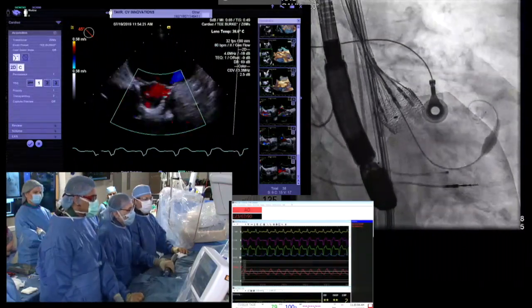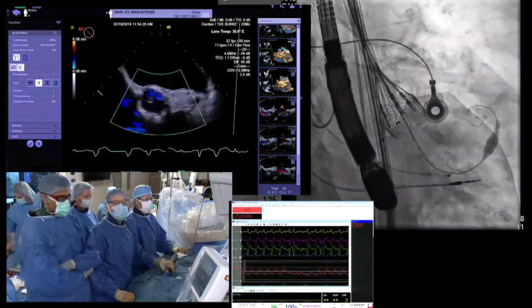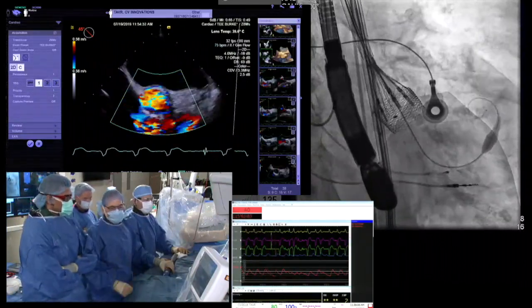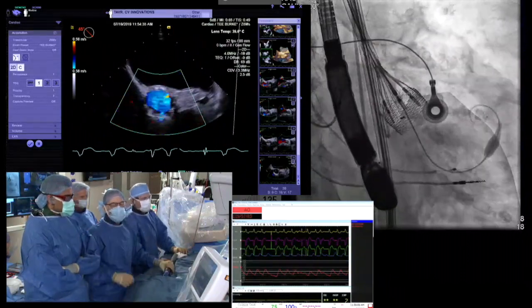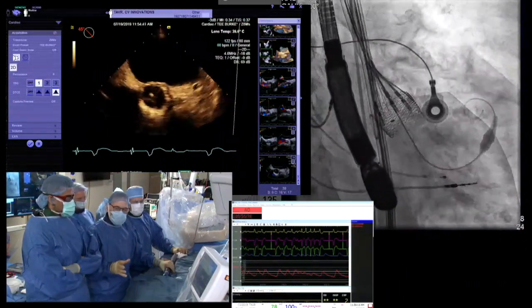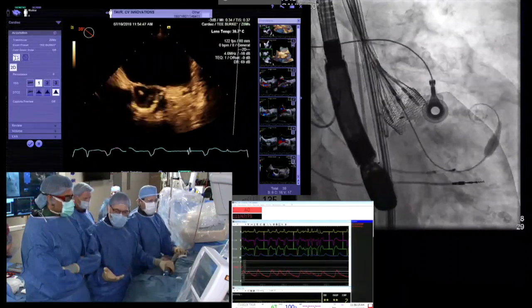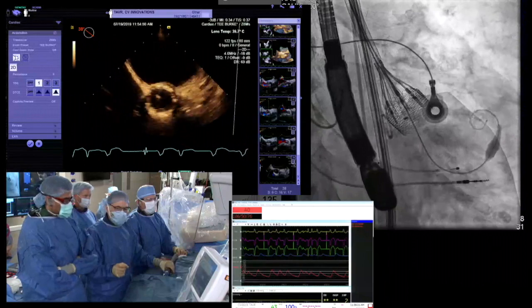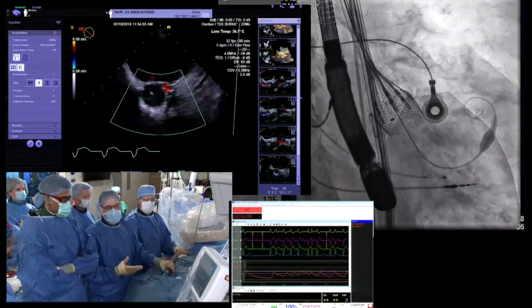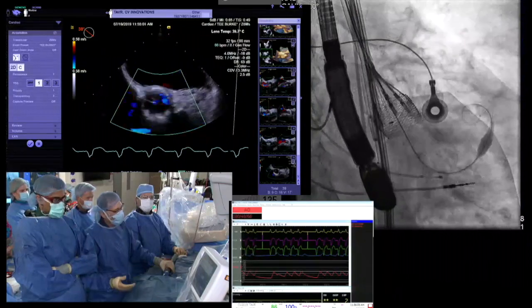Yeah, the other impression I get, Dave, is like a mulligan. If you resheath, the next time you reposition, it actually is a lot easier. I think you cause some mechanical valvuloplasty, and it just is easier to reposition if you need to. I think that's a great point. And that mechanical valvuloplasty issue comes in. We've done half a dozen bicuspids. It seemed like all the bicuspids that some of our referring physicians were sitting on, we've gotten in the last several weeks. And that mechanical valvuloplasty and repositionability really comes into play with the more complex anatomies, especially some of the bicuspid anatomy that we've treated.